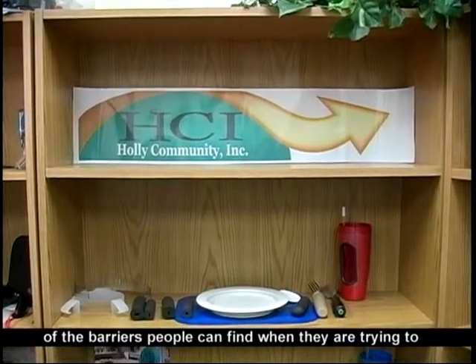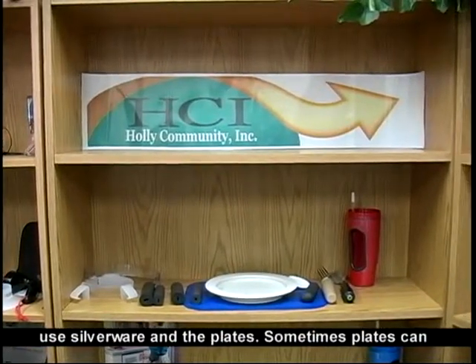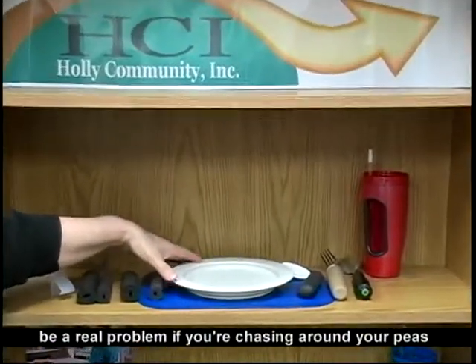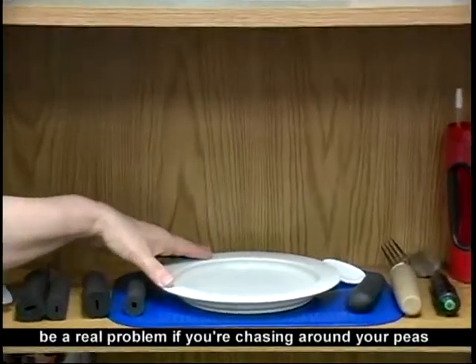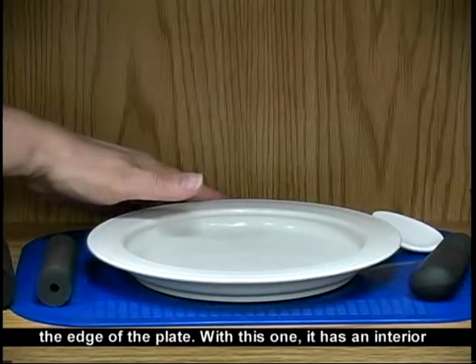Today I want to talk to you about eating and some of the barriers people can find when they're trying to use silverware and the plates. Sometimes plates can be a real problem if you're chasing around your peas and your corn and small items because they slip over the edge of the plate.